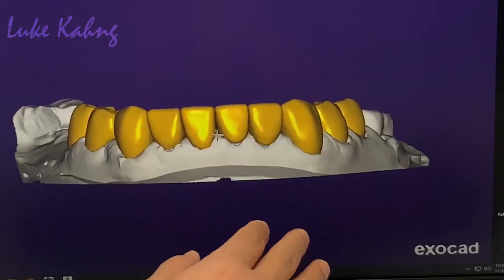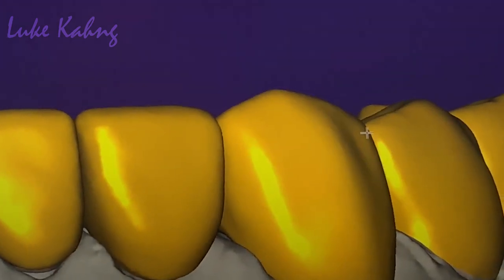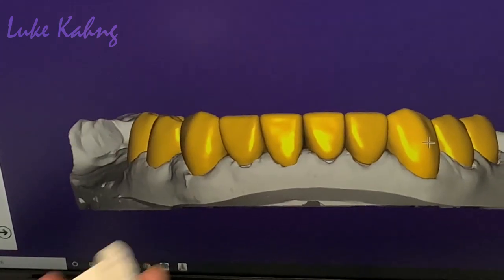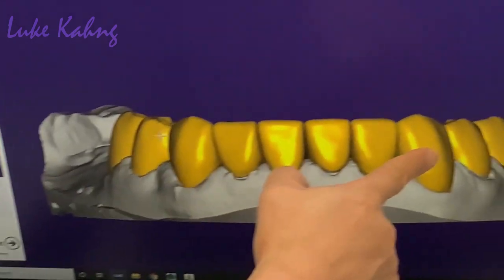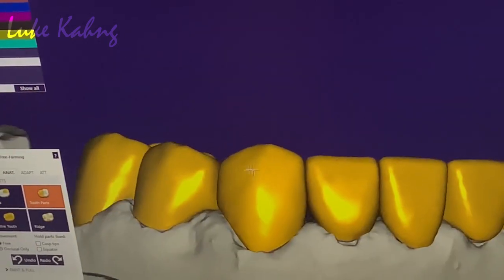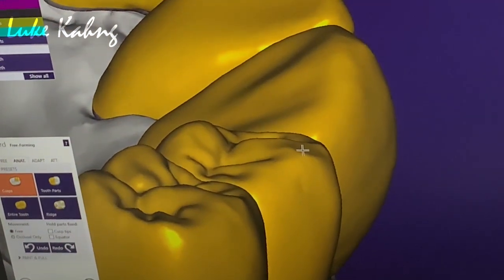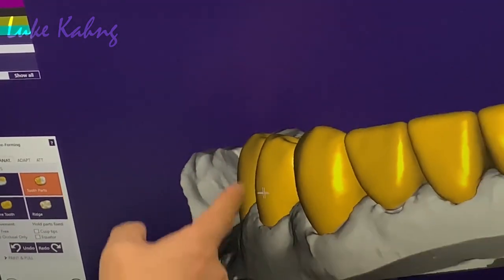No, down, okay. Now this one, this turn, tuck in. Right, okay, that's good. So, magnify, frontal view, exactly like this. Now, this canine is higher because that one's high. Canine marginal is higher and cusp as well, but still lower than. No, higher. Marginal ridge higher, cusp higher. It doesn't matter for occlusion because we're going to do the upper. We have to make it slightly out facially. Cusp high enough, that's good. Higher. Now, same.